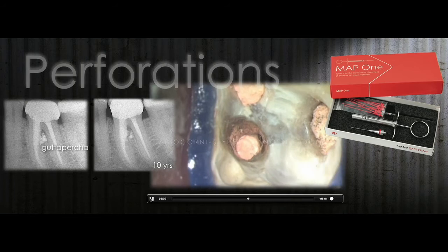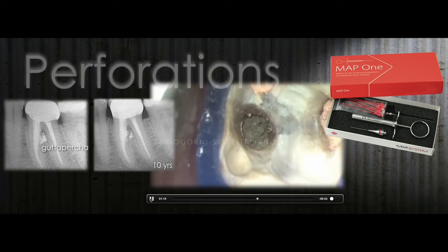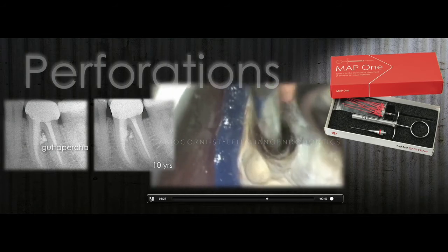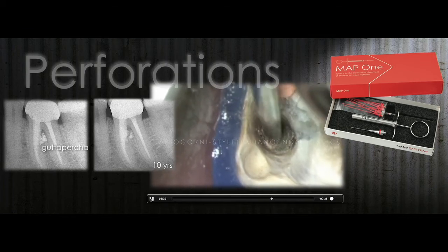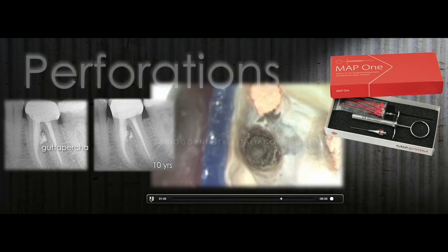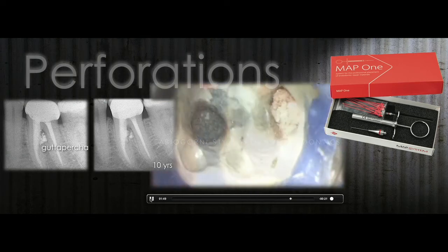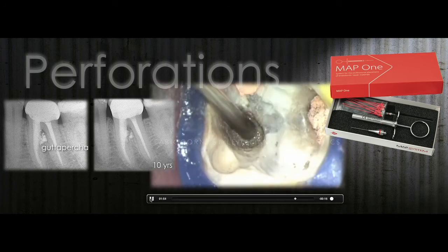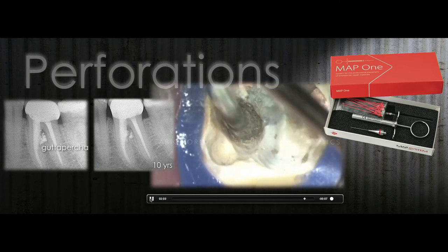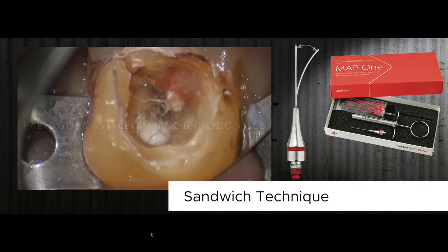It's a simple procedure. Then we can dry the area a little bit, and with the MAP system we can push the MTA inside of the roots. It's really, really simple to do, because we don't have any problem to control the MTA, and we can pack the middle 1/3 easily using a plugger. In this case we are using a gray MTA. We are talking about a very old case, more than 15 years ago, but the technique is even the same. With the MAP system or with the MAP One, we can bring the material easily inside of the canal and control everything.